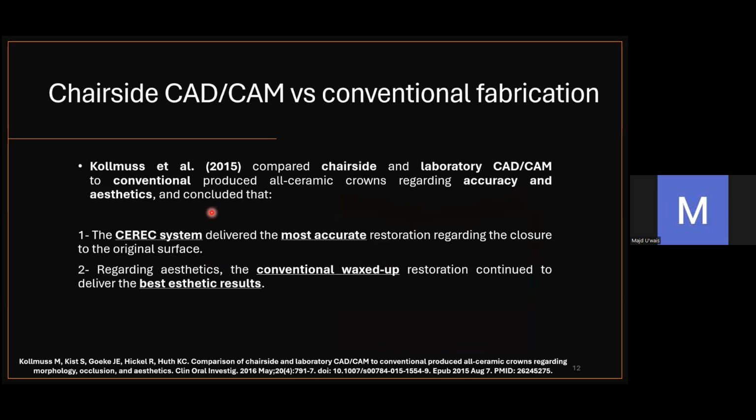Regarding the comparison between the chairside CAD/CAM and the conventional fabrication, Kolmas and his colleagues in 2015 compared the chairside and laboratory CAD/CAM to the conventionally produced all-ceramic crowns regarding accuracy and aesthetics.